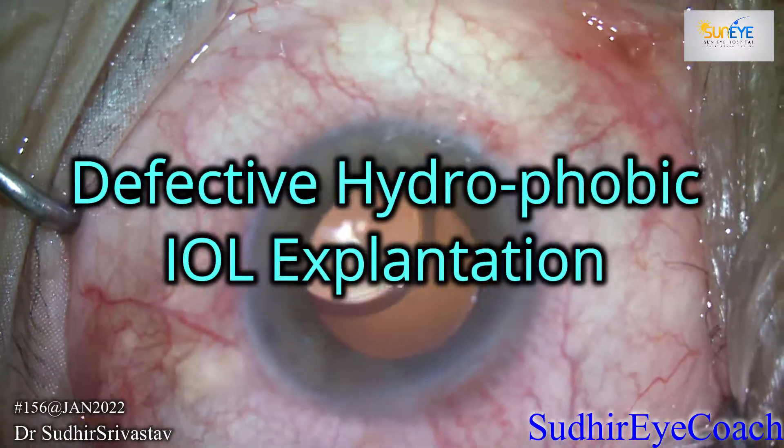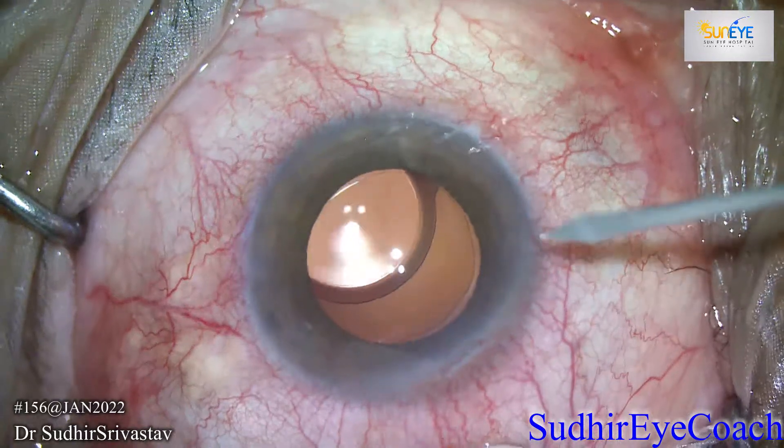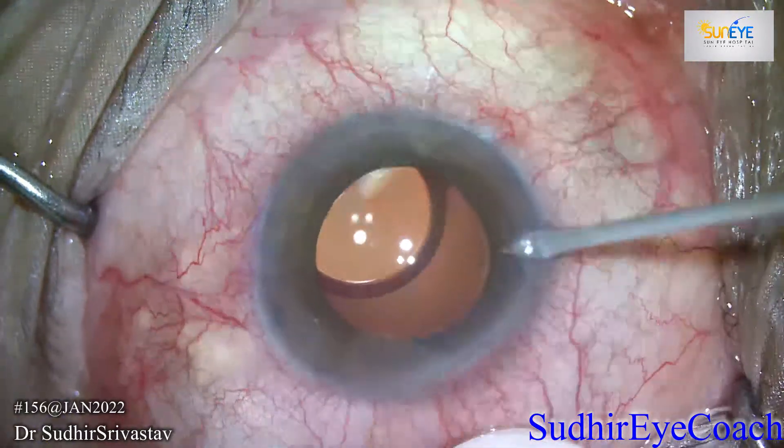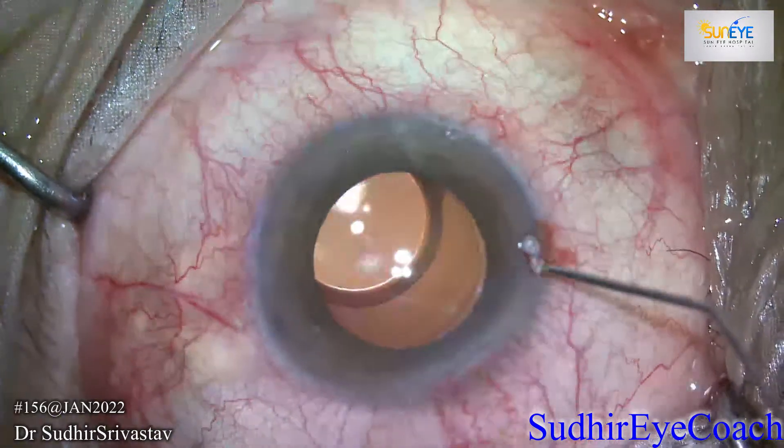Hello everyone, welcome to Sudhir's coaching channel for budding ophthalmologists. As you all know, in the last few decades we have seen so many advancements in cataract surgery; however, it is still not flawless, and there is still a quest for the best IOL and best delivery system to inject the IOL inside the eye.